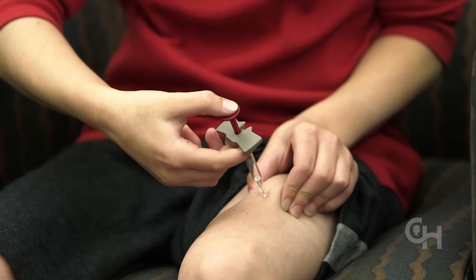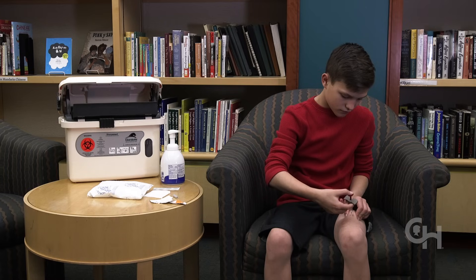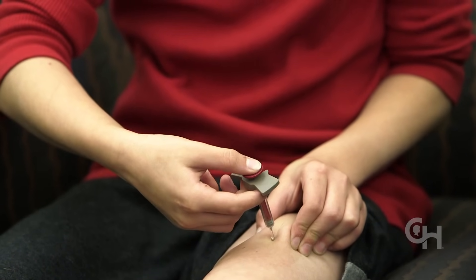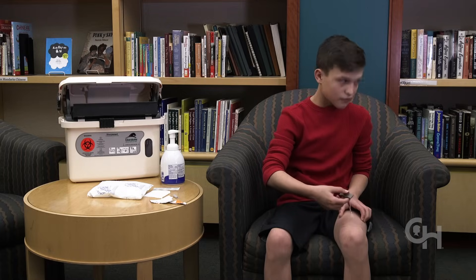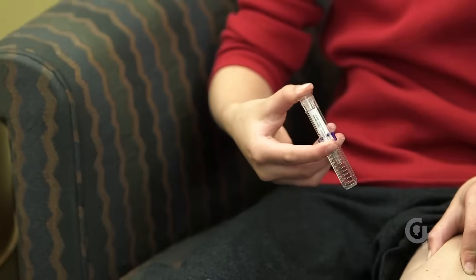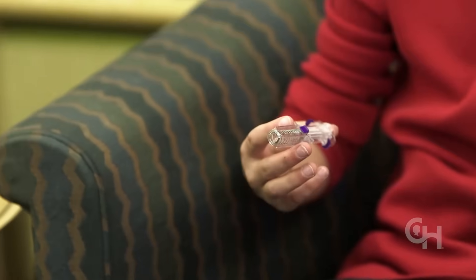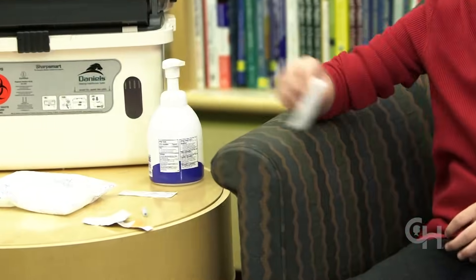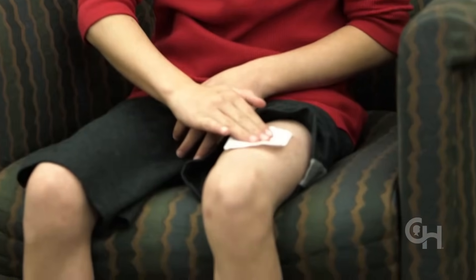Hold the syringe like a pencil and quickly insert the needle through the skin. Slowly push the plunger all the way down into the syringe. Release the pinch of skin slowly, then pull the needle out of the skin. Some medicines, like Stelara, come in syringes that automatically cover the needle. You can apply pressure to the site with a cotton ball or a piece of gauze.